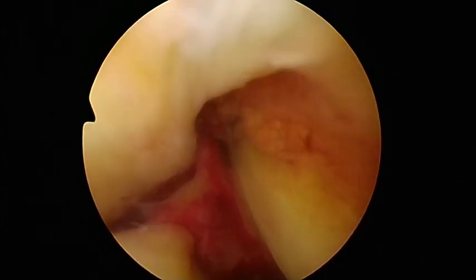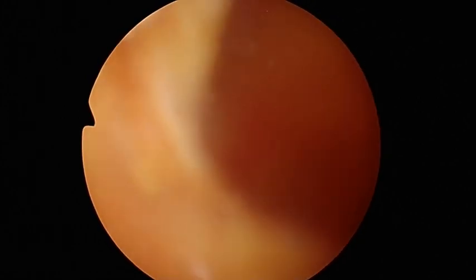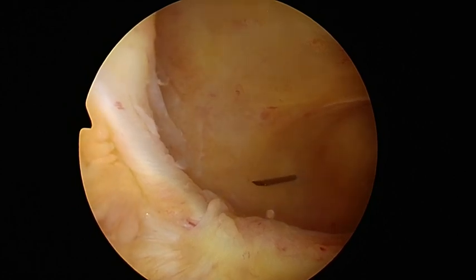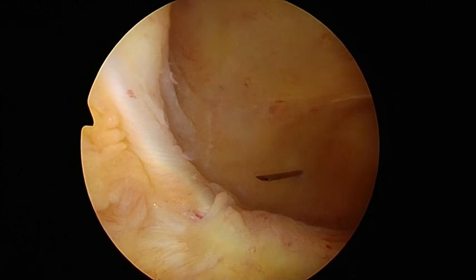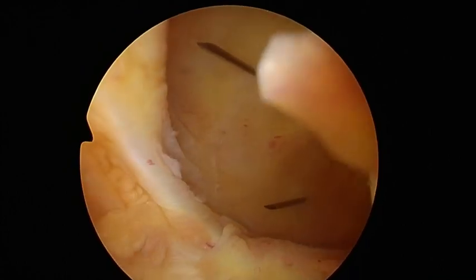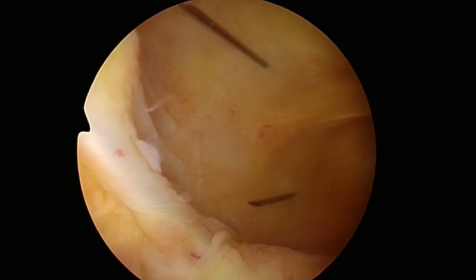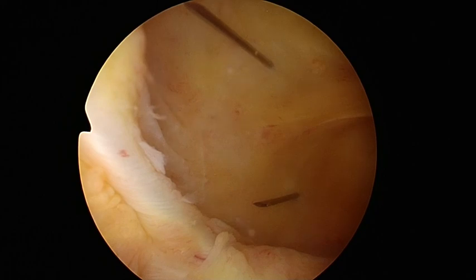Next, two posteromedial portals are created. The posteromedial area is visualized from the anteromedial portal, and two catheterized needles are inserted to establish high and low posteromedial portals. The low portal is positioned approximately 5 mm proximal to the medial meniscus, while the high portal is as proximal as possible.